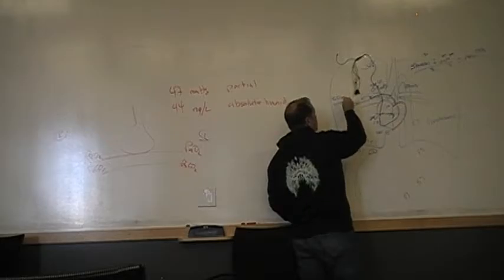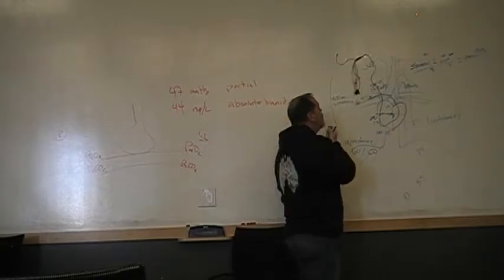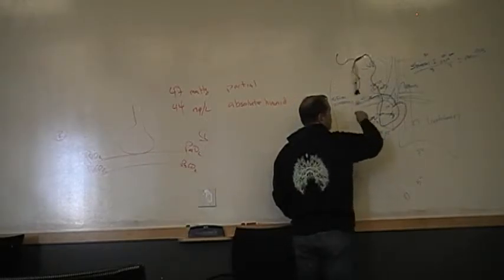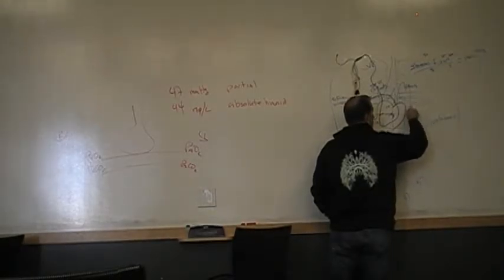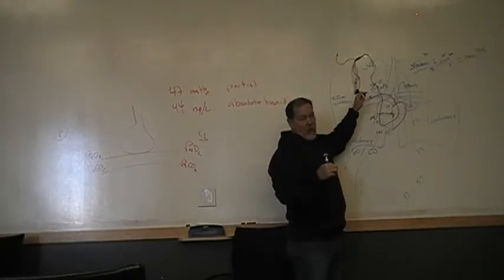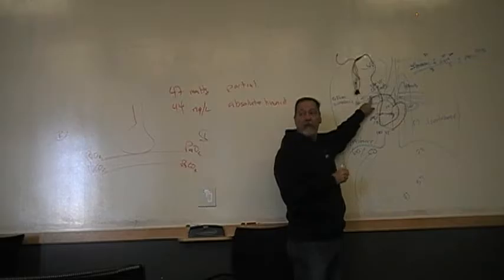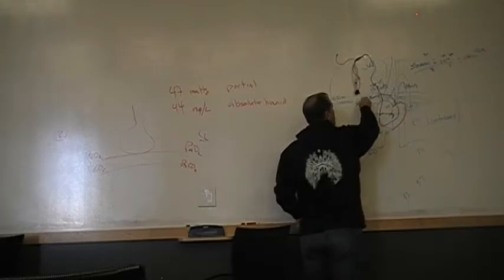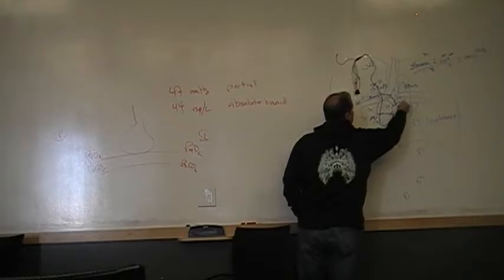And if there's no flow and then there's no resistance, then the blood pressure here at the distal tip of that catheter is the same throughout all of this vasculature back to, and representative of, LAP, left atrial pressure. So you have to make some assumptions that at the tip of this catheter, if you're measuring no flow beyond the tip of the catheter, if there's no flow, there's no resistance. If there's no resistance, then the pressure right here is the same as right here, is the same as here, and same as here, leading back to there.